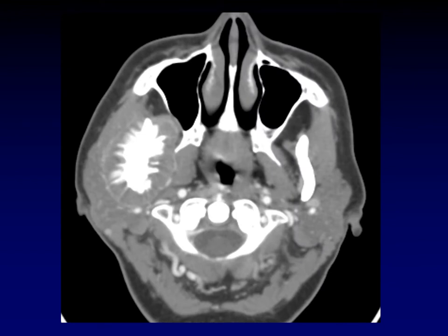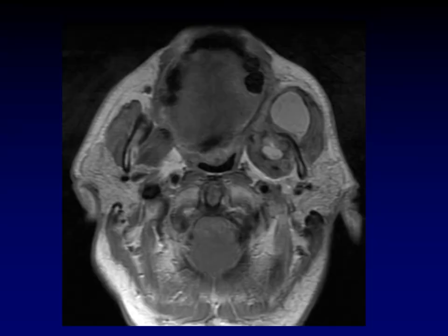Here's another more aggressive-looking mass in the masticator space, pushing on the parapharyngeal fat predominantly medially and a little bit posteriorly. This lesion is obviously arising from the jaw itself — it turns out to be a Ewing sarcoma, which you might have guessed from the hair-on-end or starburst pattern of bone. Here is another tumor arising from the mandible itself: a mucoepidermoid carcinoma of the mandible, a relatively unusual histology for that location.